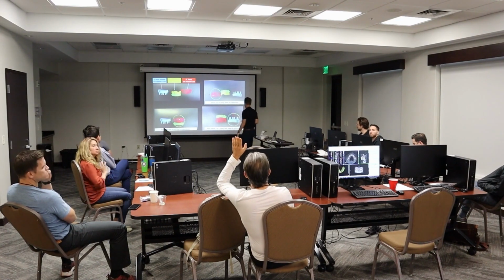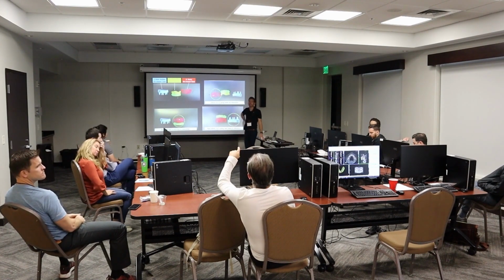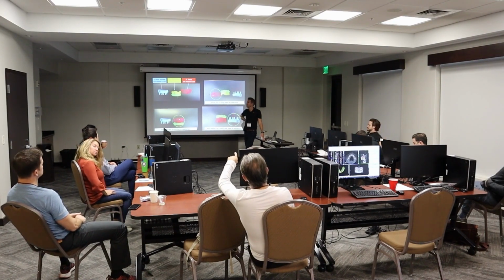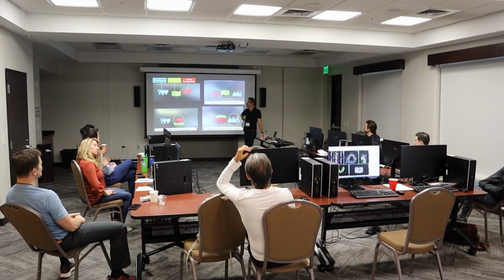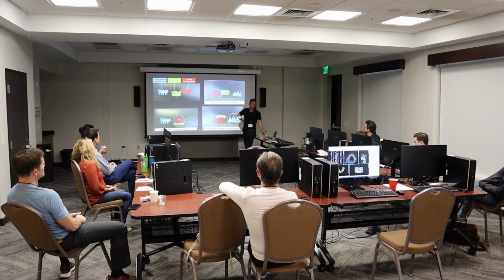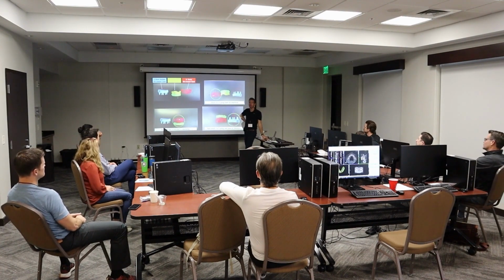Except for iTero, that can do the 3rd scan, my cone beam has a scan function. Would that be good enough too, or technically no? I think yes. I think absolutely, because the accuracy of that scan is not critical.